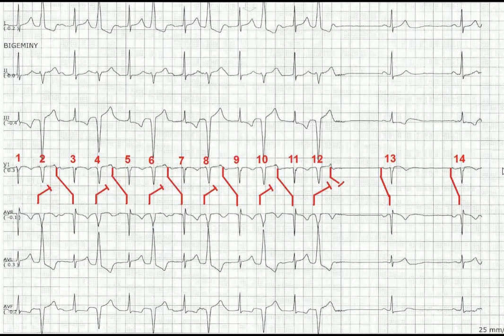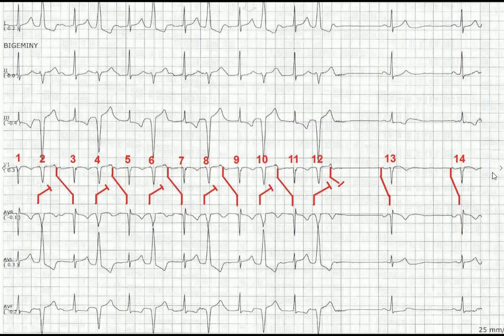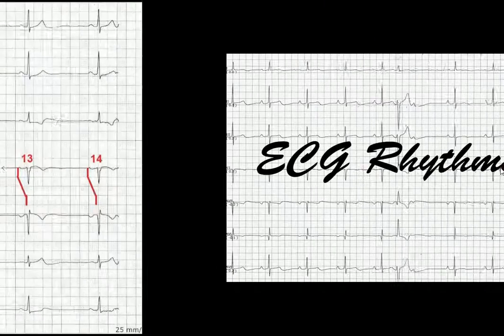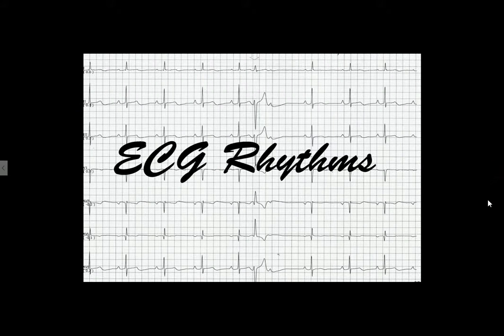I hope you liked this EKG. The next time you see sudden prolongation of a PR interval or a dropped P wave, look for this behavior — it might be concealed retrograde conduction of a PVC. Thank you and have a good day.